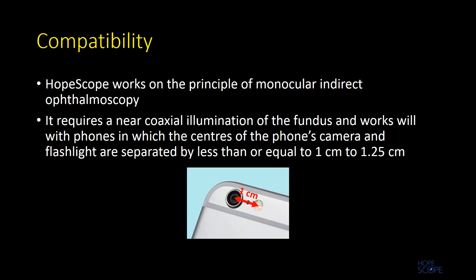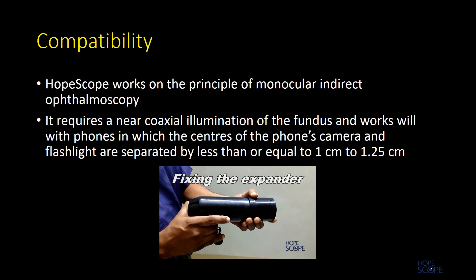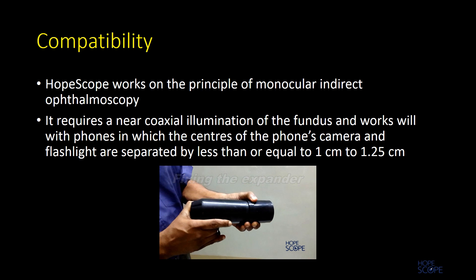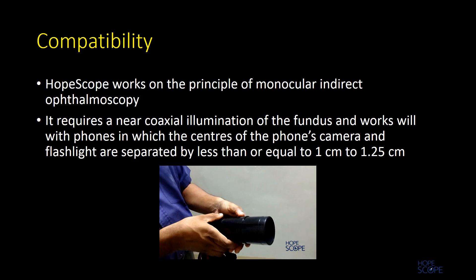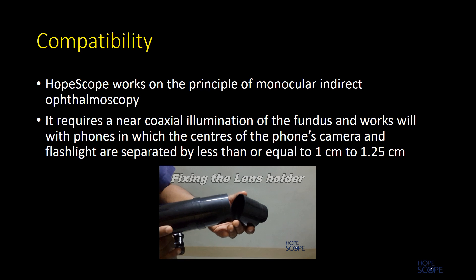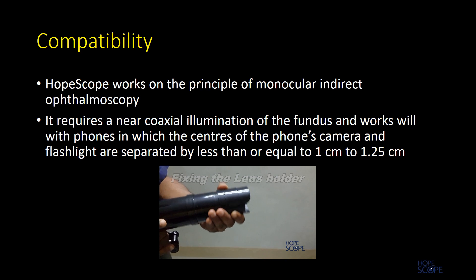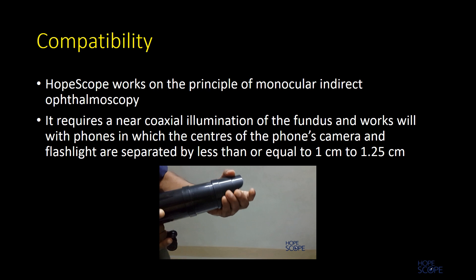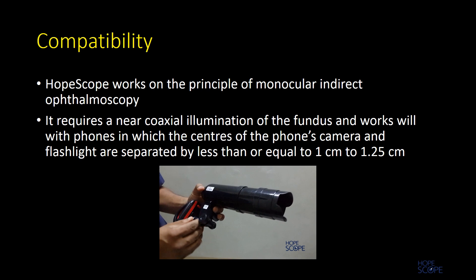An ideal camera-to-flash distance will be one centimeter or less, and the device can be used as-is for such a phone. If that distance is more than 1.25 centimeters but less than 1.5 centimeters, one has to expand the length of the optical tube by attaching the expander to the optical tube, followed by the lens holder to the expander. This lengthens the optical tube, giving the illumination beam enough distance to reach coaxiality.